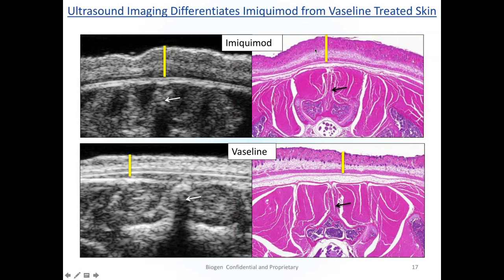Yeah, no, it is a nice comparison for that reason. If you were just using the ultrasound image, it might be difficult to distinguish some of these layers. Then you have the histology, and you go back to the ultrasound and say, oh yeah, I see this layer here, and I see how it correlates with that. Yeah, that's nice.